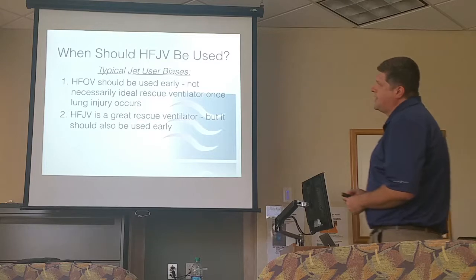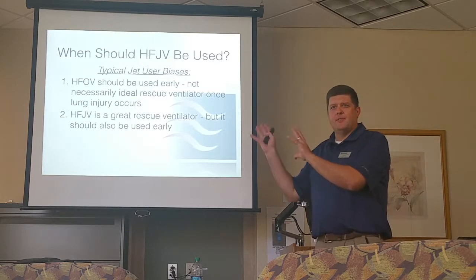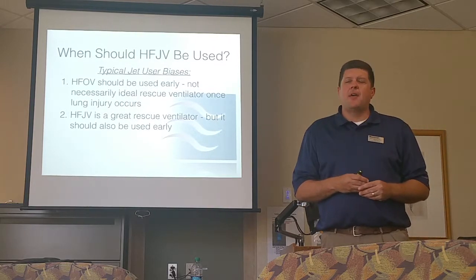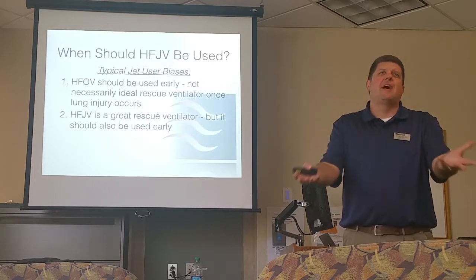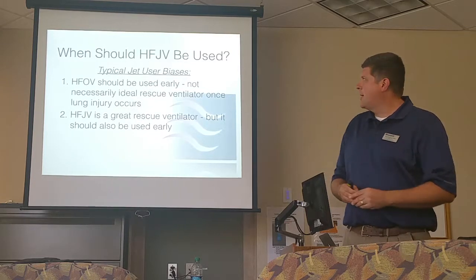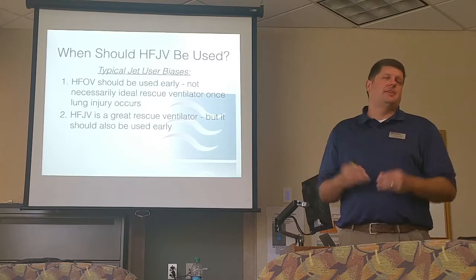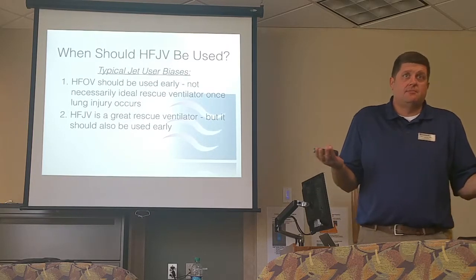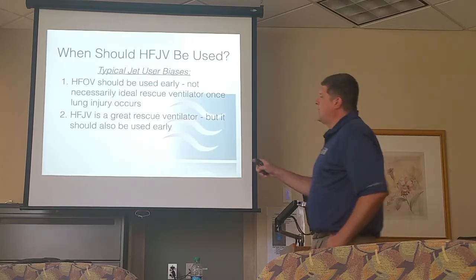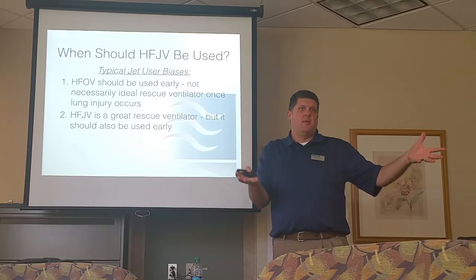So for many of the facilities I've visited over the years, this is their mentality of using both machines. If you have a little 25 weeker, I think using a jet or an oscillator right off the bat is perfect. They're great at preventing lung injury. Most facilities just wait to pull out the jet until the oscillator shows that it's not effective anymore. And that's fine too. But I don't want the mentality of the jet being a last ditch effort to be what we take away.